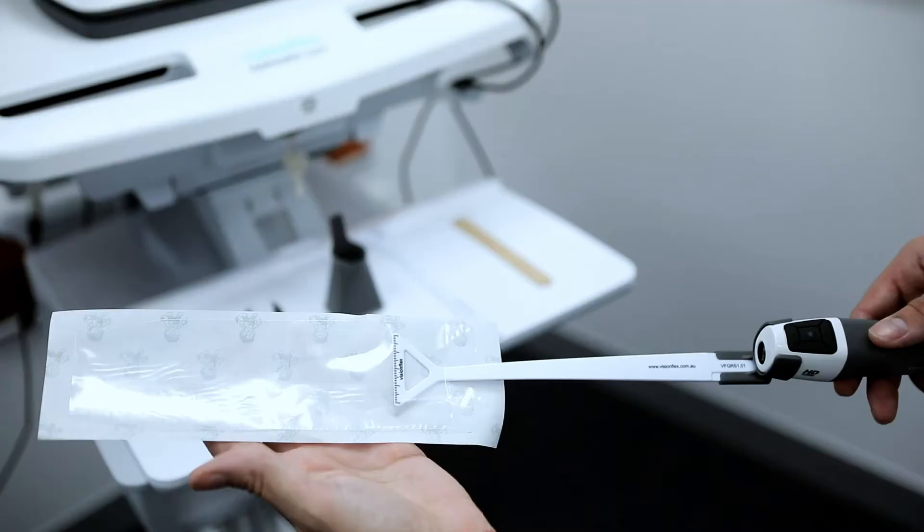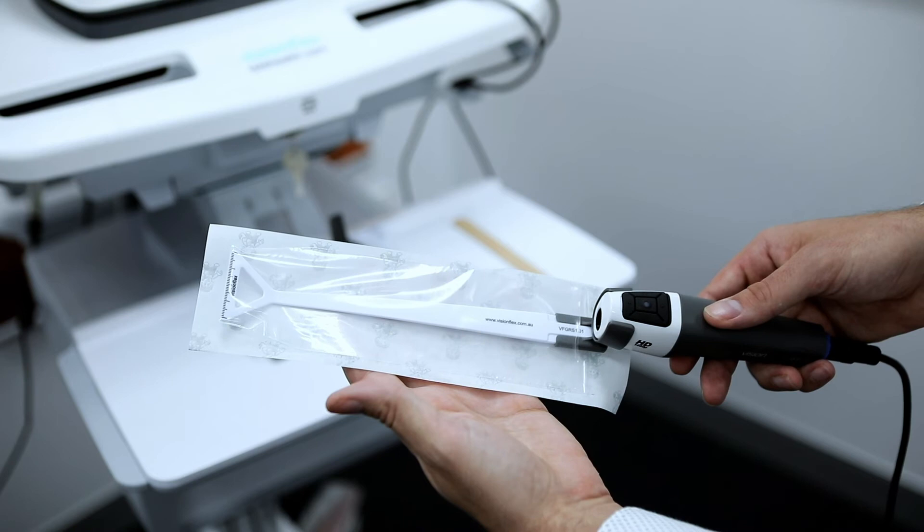The stick is 200mm long with a 40mm end that features a millimetre scale for accuracy. The kit comes with hygienic disposable sheets that fit over the stick.